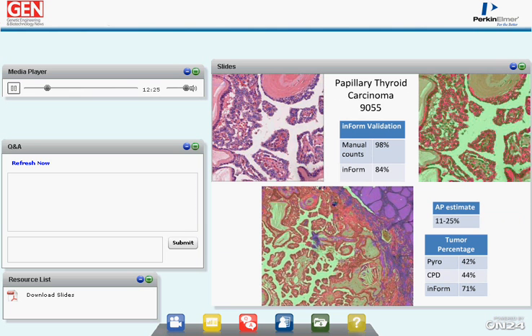And here was another one where the anatomic pathologist underestimated the tumor abundance, where they were scoring it at around 10 to 25%, and the allele frequencies by gene sequencing were in the 40s, and by machine learning were as high as 70%.